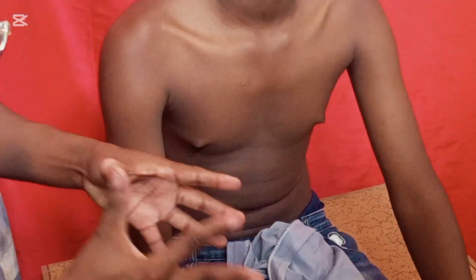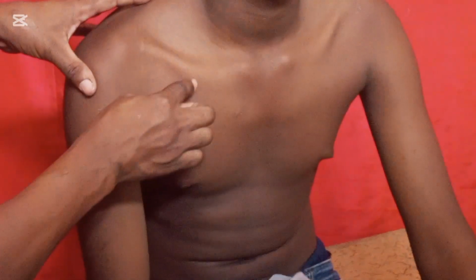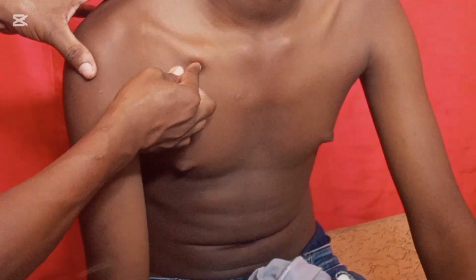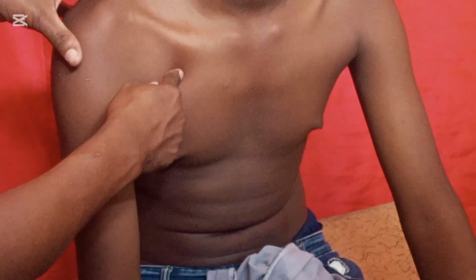Okay, this is how you're going to locate the area where we're going to listen to the heart sound. For example, here are the clavicles, and here is the first intercostal space. Then we have the second intercostal space. This is the area where we are going to listen to the heart sound.